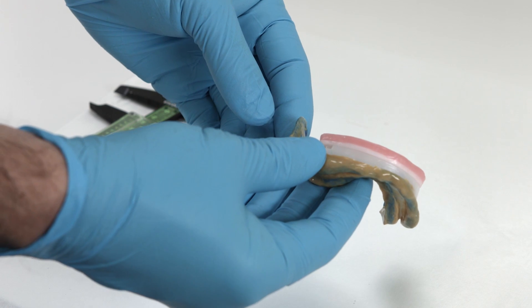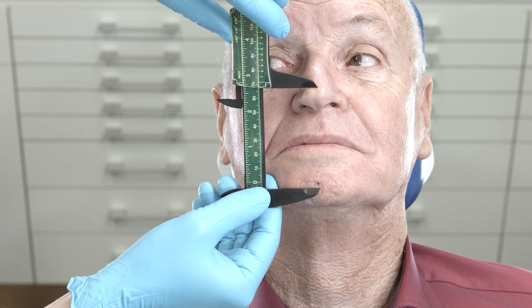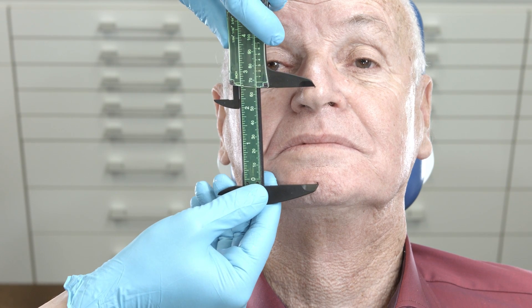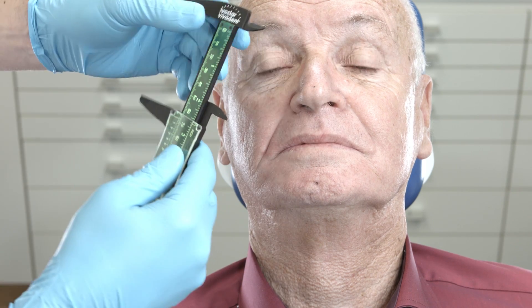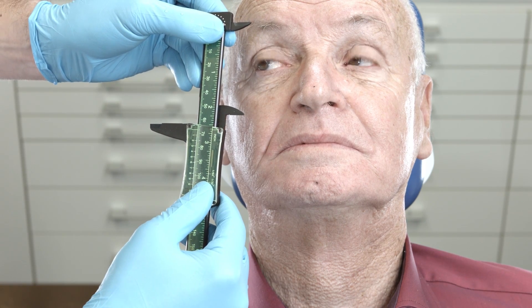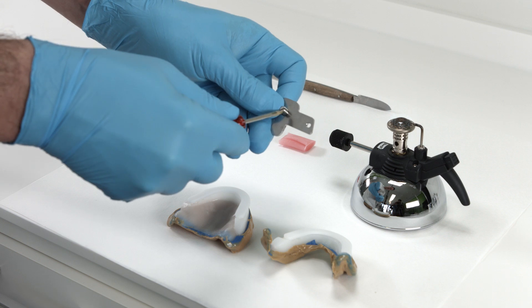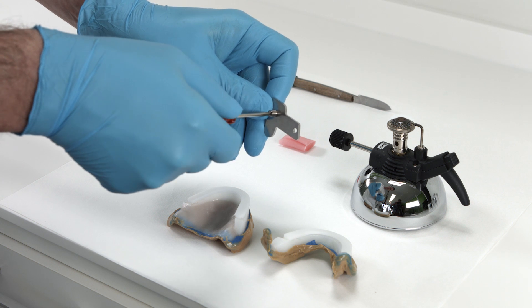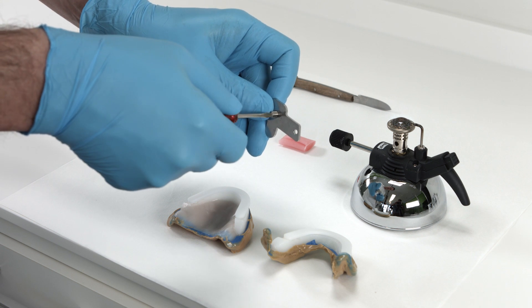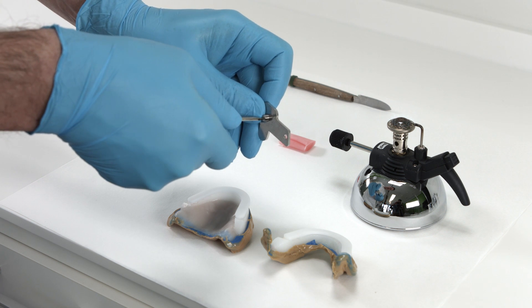If the vertical dimension is too low, you can increase it in millimeters with wax plates. The final vertical dimension can also be determined by establishing the dimension of rest and the vertical dimension with calipers and making the necessary adjustments. Any adjustments are later transferred to the stylus of the Nathometer CAD. A turn to the right will raise the stylus, while a turn to the left will lower it.